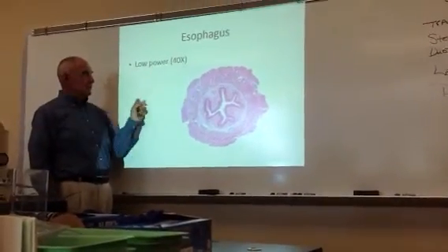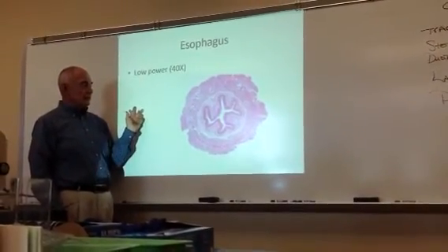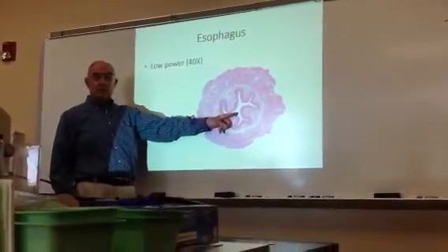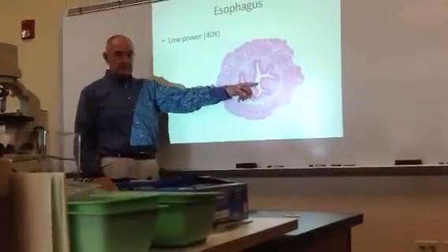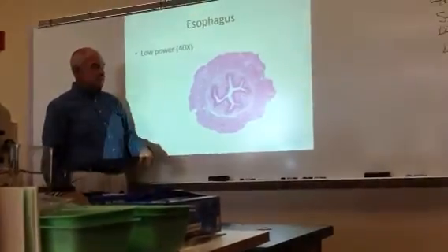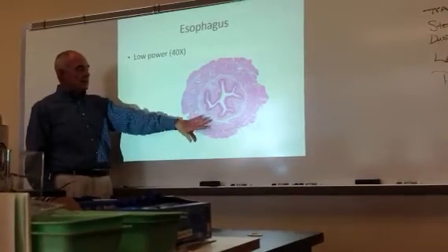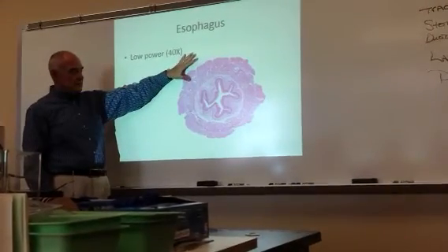The trachea is always wide open with a big wide open lumen, and the esophagus is always collapsed. So if you can find that tube that the lumen has collapsed in on, that's got to be the esophagus. Okay, even right here we can see that there are distinct layers.